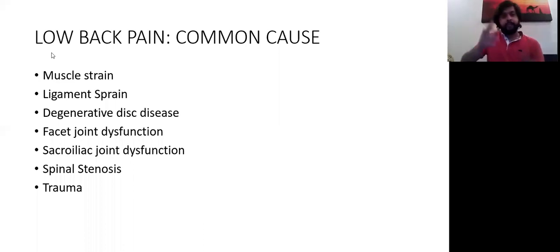So with low back pain, when you balance the mechanics and activate the muscles accordingly, you can sort out the problem. But what to do with IASTM when there is low back pain? When we talk about low back pain, I personally prefer the IASTM tool, because there are big muscles over there. Using my hands or thumb, digging into the muscles gives me so much trouble. And again, I said I'm the most important person in the room. If I'm not happy, if I'm not comfortable, I can't give comfort to the patient.